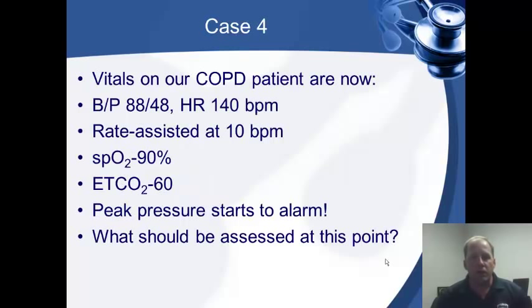Your vitals on your COPD patient now: his pressure has dropped to 88 over 48, and his heart rate is up to 140. We're assisting his respirations at 10, sats are still low at 90, and his CO2 is still high at 60. So the peak pressure starts to alarm.